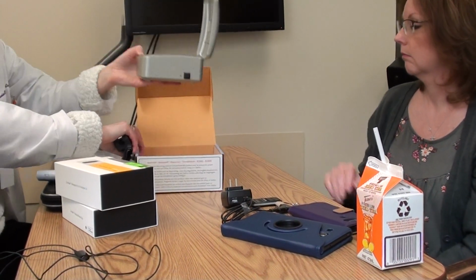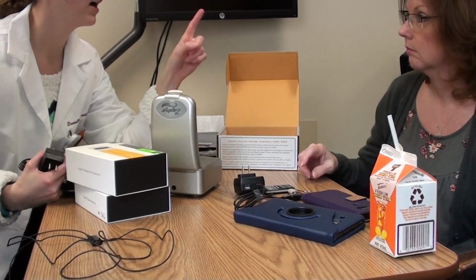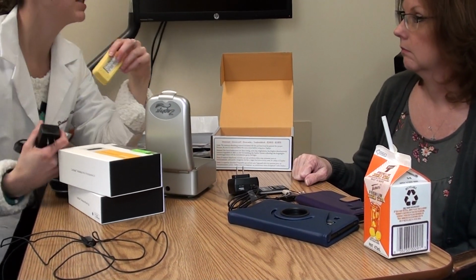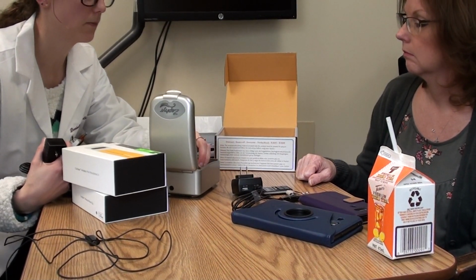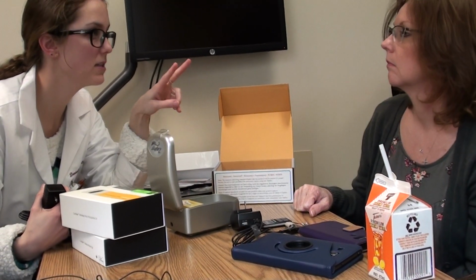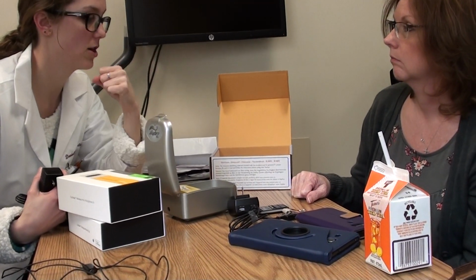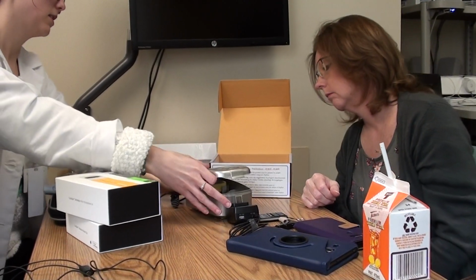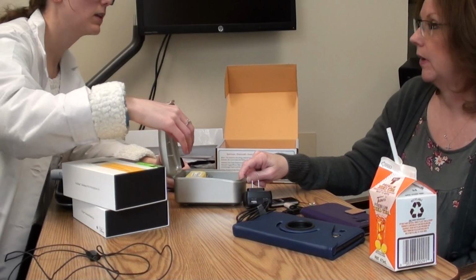So you'll take it off to go to bed. You'll put the battery on the charger, and then you're gonna put the processor into here. It'll pull moisture out of it. They say they last about 2 months, but they're good for about 3 months. This is what pulls that moisture out of it. And you plug this into the back here, and plug this into the wall. So I'll put that on there every night before I go to bed?